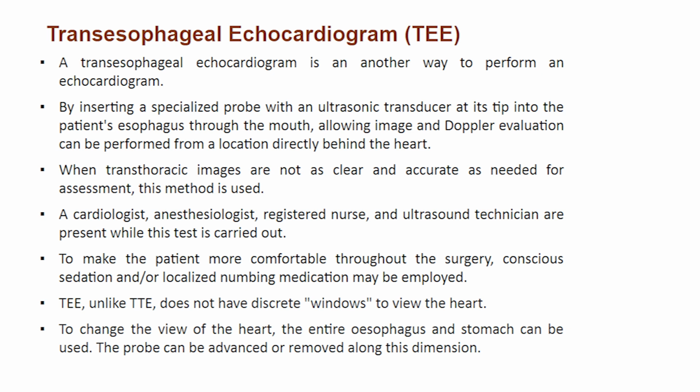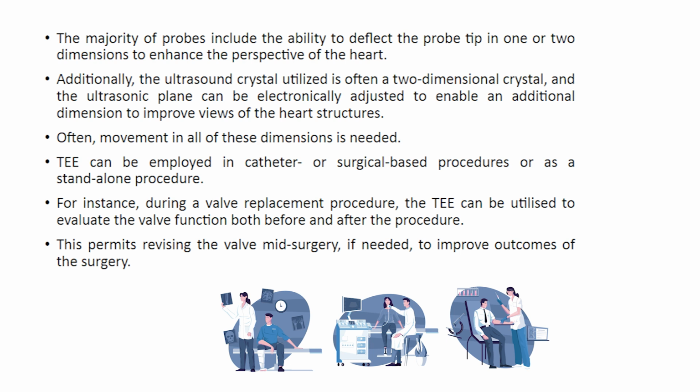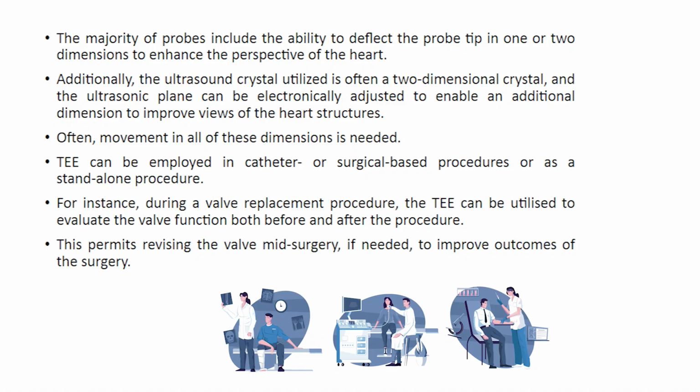The probe can be advanced or removed along this dimension. The majority of probes include the ability to deflect the probe tip in one or two dimensions to enhance the perspective of the heart. Additionally, the ultrasound crystal utilized is often a two-dimensional crystal, and the ultrasonic plane can be electronically adjusted to enable an additional dimension to improve views of the heart structures. Often, movement in all of these dimensions is needed.